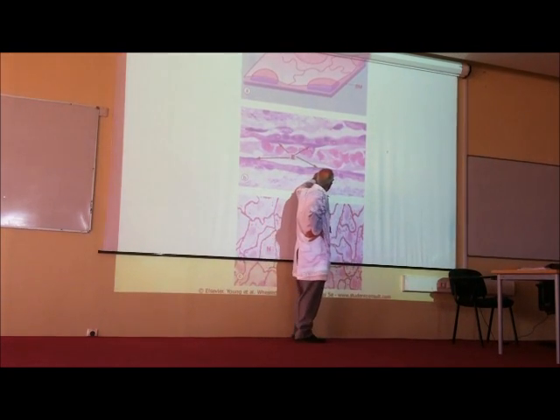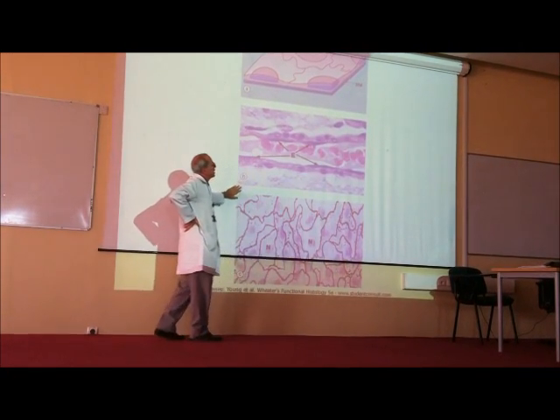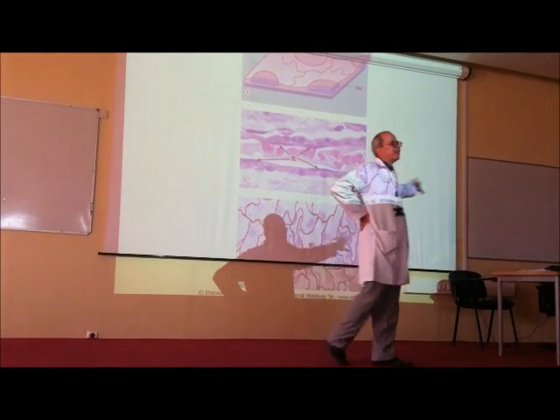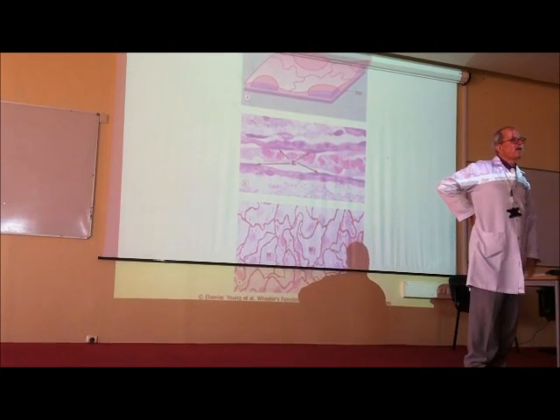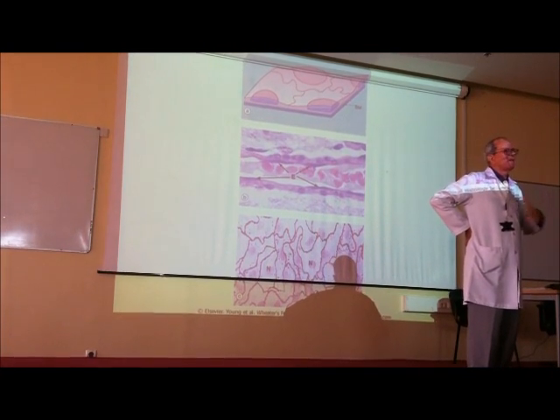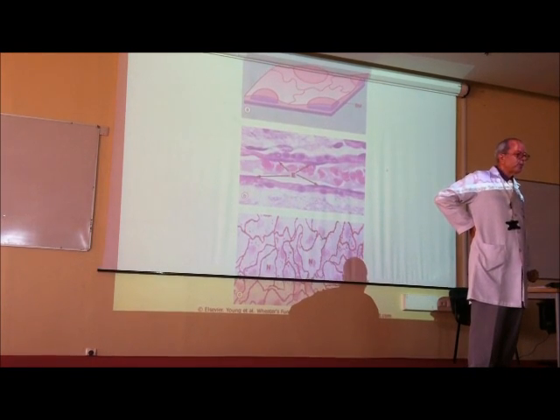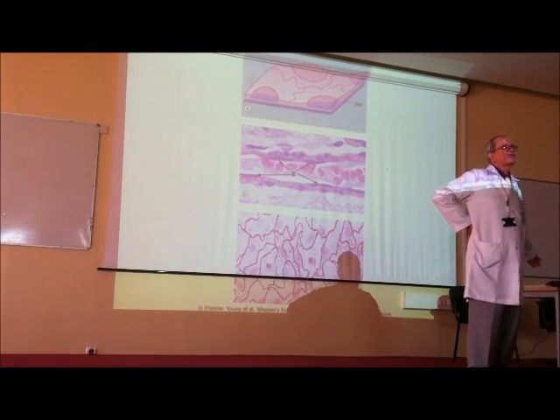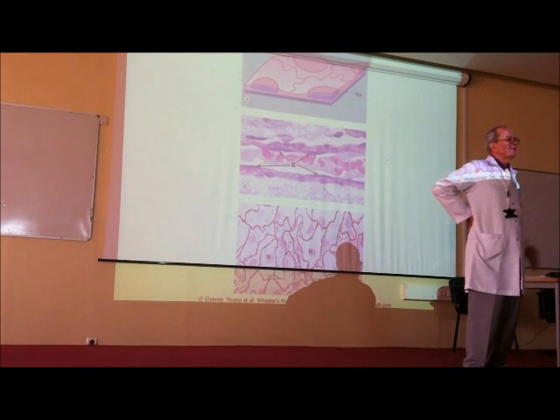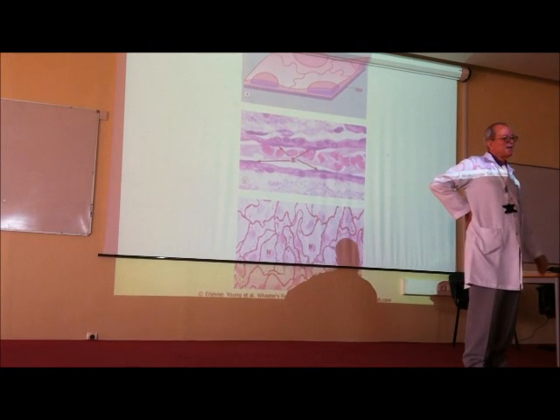Simple squamous endothelium, or a blood vessel lined by simple squamous endothelium. And then I'll start to ask you about the epithelium. But after we take the blood vessels, I'll ask you about the blood vessel and the epithelium in the final. Clear? Or repeat again? So this picture, you may get in the first exam or the second, at the midterm or at the end of the second term.